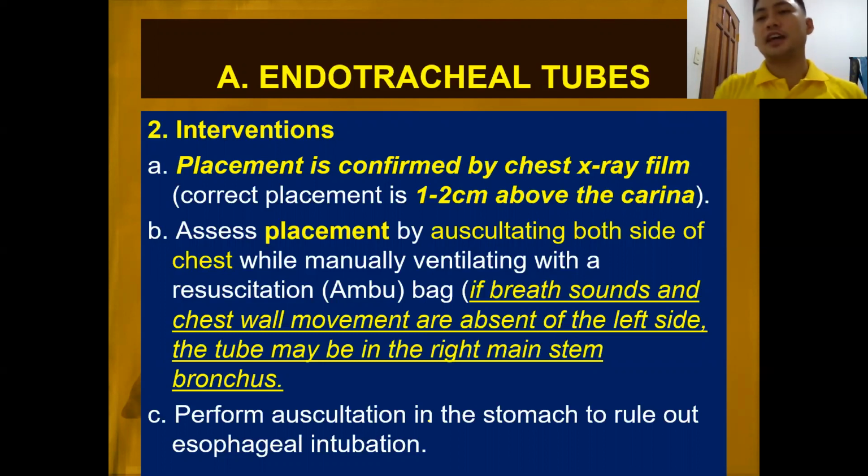So dapat equal ang marinig mo during auscultation. So kapag malakas dito, mahina sa kabila, meaning to say more or less the ET tube is inserted too deep and it is placed into the right primary bronchus. So, kailangan i-withdraw konti ng doctor.